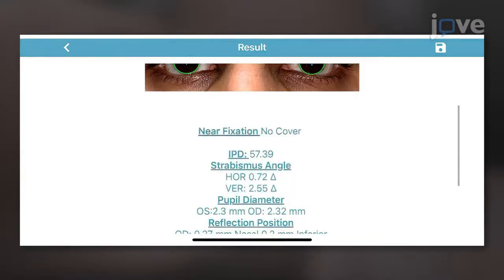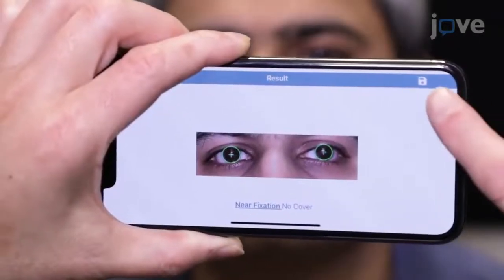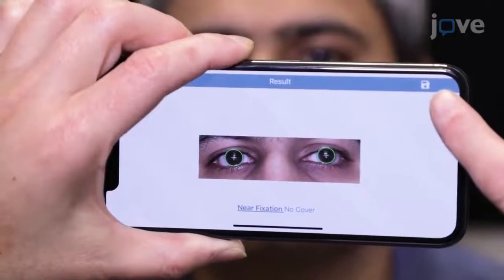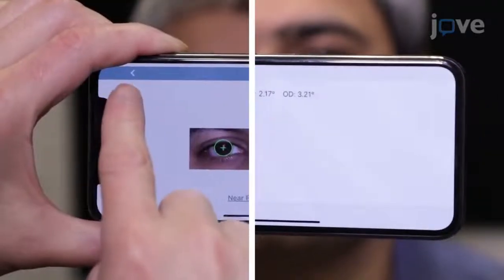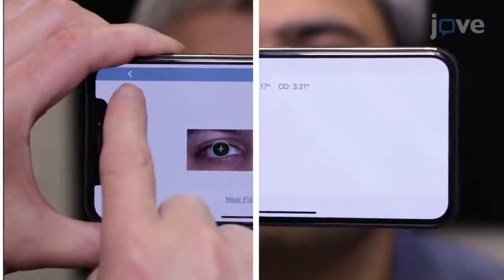Then press the Save button to save the current test on the phone, or press the back arrow button to retest.